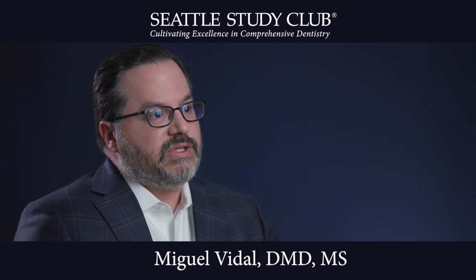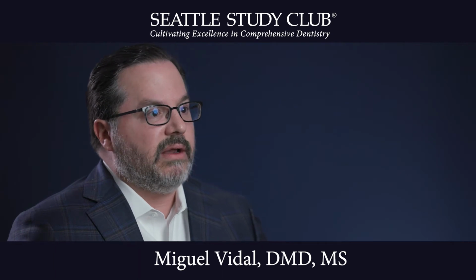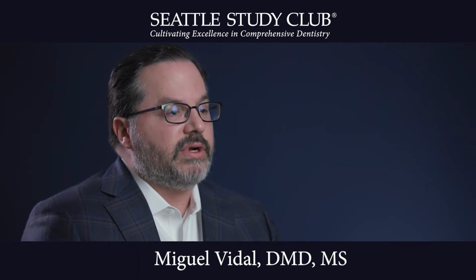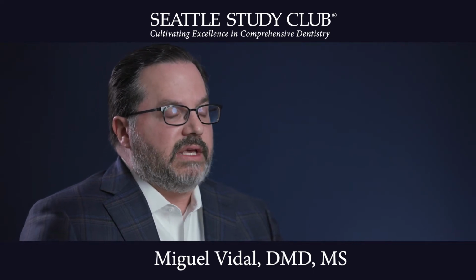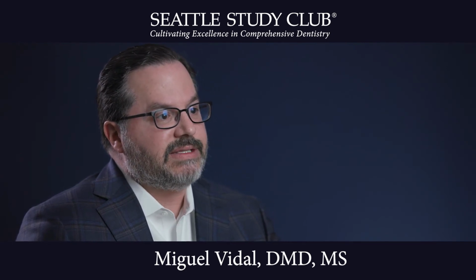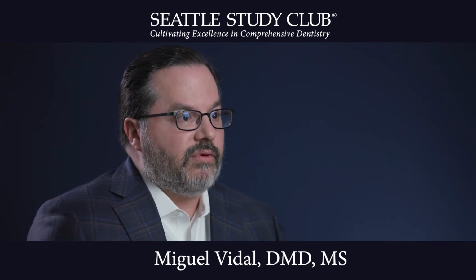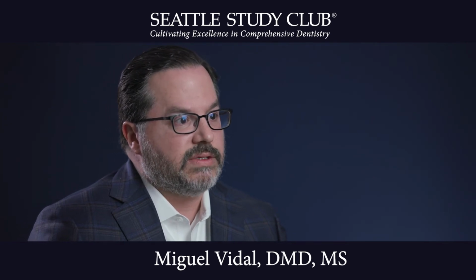And does the margin placement and the abutment height actually influence that? There are several studies that do show that, and conclusively show that the taller the distance is, 2 millimeters or more, the more likely you are to preserve your bone. And that's even with implants that have a platform switch design. Conversely, the closer you get to the platform of the implant, and anything less than 2 millimeters, especially for implants that are non-platform switched, have conclusively shown that they exhibit bone loss in these areas.